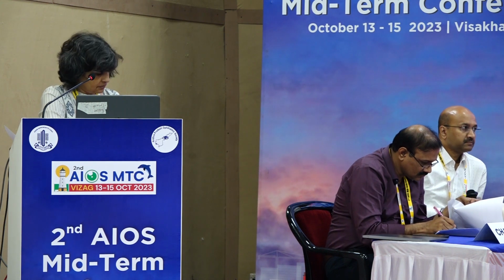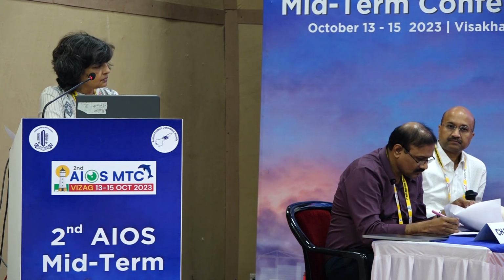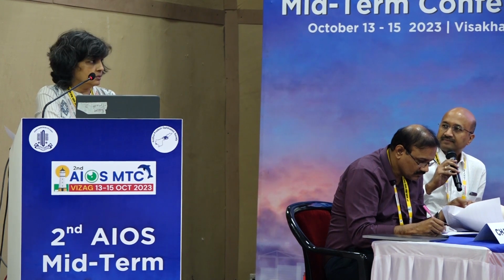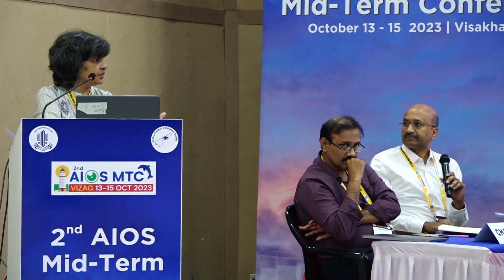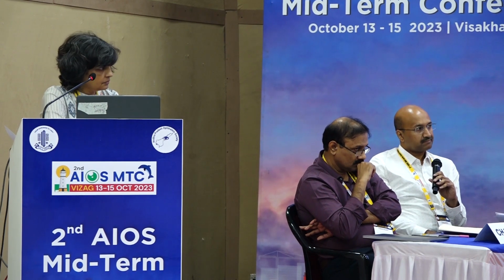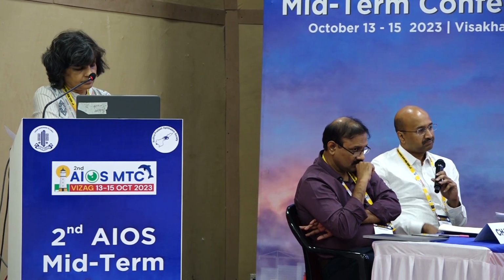I had it on the immediate post-op day, but within 3 days everything cleared with the topical steroids. But somehow I was very scared to use it again. I've used it in many cases, no problems, not even reactions on the next post-op day. Absolutely. Sometimes if excess injection is given, it may go and collect in the anterior chamber. But the glue control is so difficult under air, the one drop you have to put, that is not easy to happen.